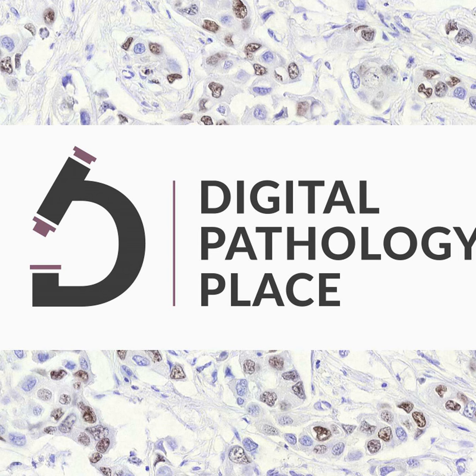They are arising from model limitations and data discrepancies between model deployment and development environments. This is super important. Discrepancies, deployment and development. So let me talk a little bit about that. If you want to build a medical device, let's say you want to build an AI model that is a medical device everybody can use, do you have data from everybody to train on? No. So you figure out ways to make this algorithm generalizable. But is there a guarantee that it's so generalizable that it's going to work on everything? No. Development and deployment, right?